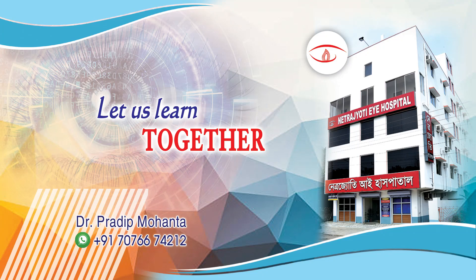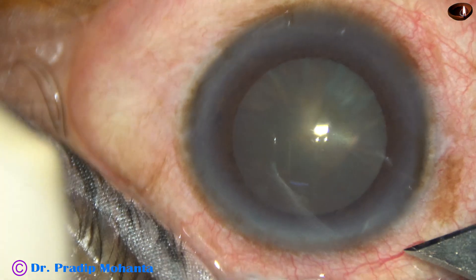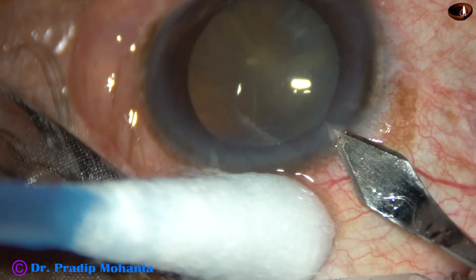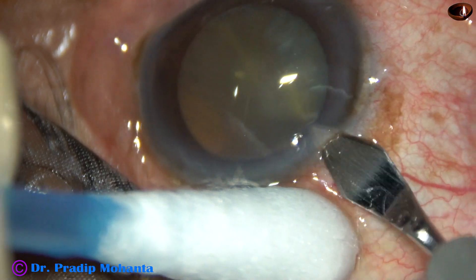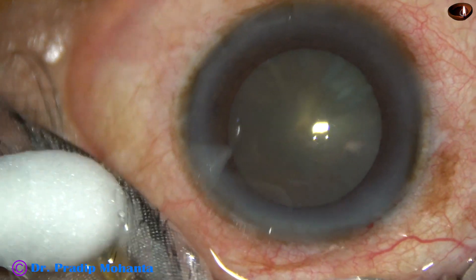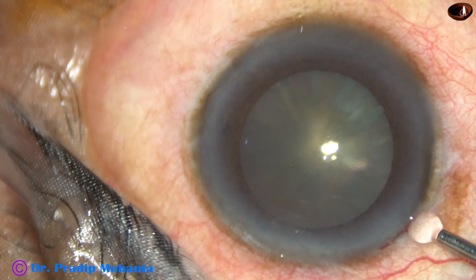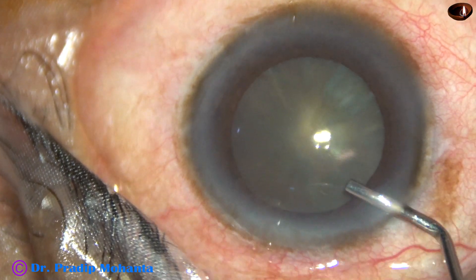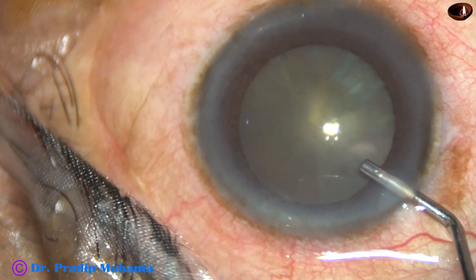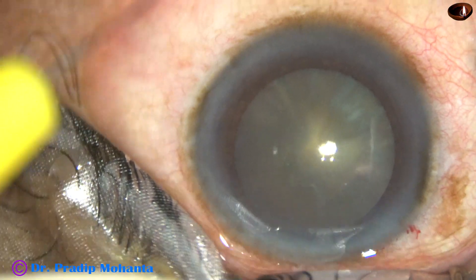Friends, welcome to my workplace at Ranaghat, West Bengal, India. This is a soft cataract. Nuclear sclerosis in this case is grade two. Let us observe this surgery. In this surgery, my aim is to show you mechanical chop in slow motion, so that you can use this technique in your surgery and manage such cases in your practice.